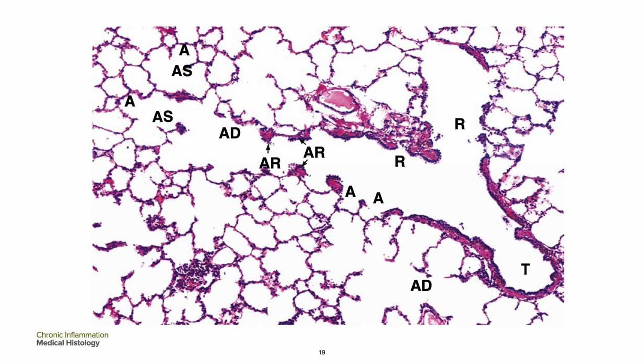The epithelium of the respiratory bronchioles is devoid of goblet cells and largely consists of ciliated cuboidal cells and smaller numbers of non-ciliated cells called Clara cells. In the most distal part of the respiratory bronchioles, Clara cells become the predominant cell type.